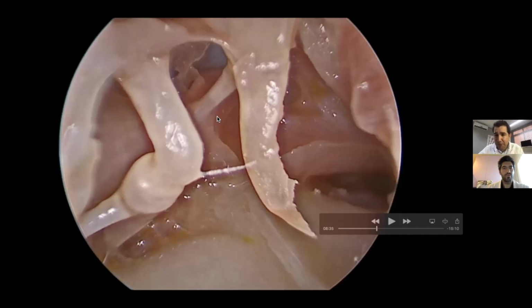Sometimes you can have an acute otitis media during childhood, or edema of this mucosa here because of inflammation, because of infection, whatever. And then you can have a fibrous disease, or a web, or scar tissue in this tympanic isthmus.